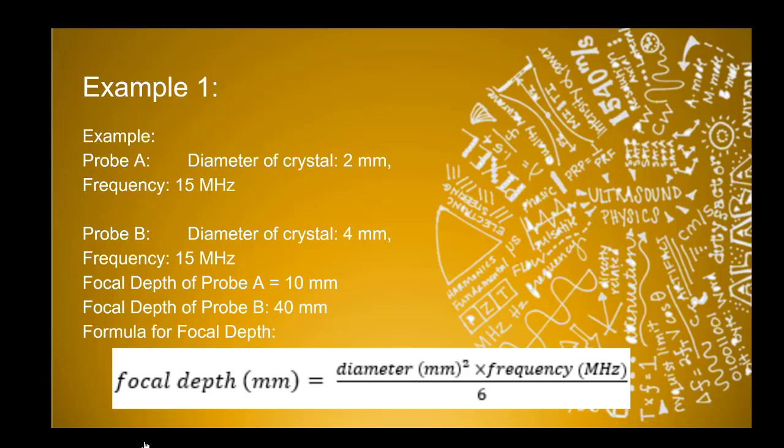So let's take a look at some of the math. And this is another formula that you don't need to know. Do not waste your time memorizing it, but I just want to show you how the diameter and the frequency of the transducer change the focal depth.